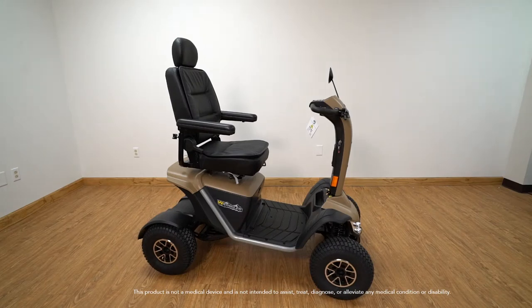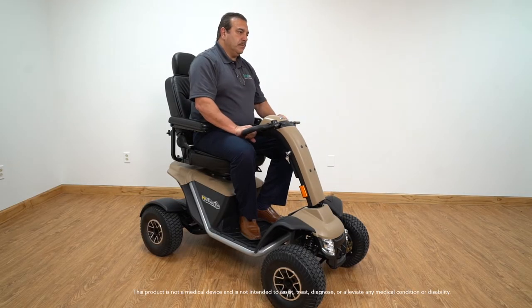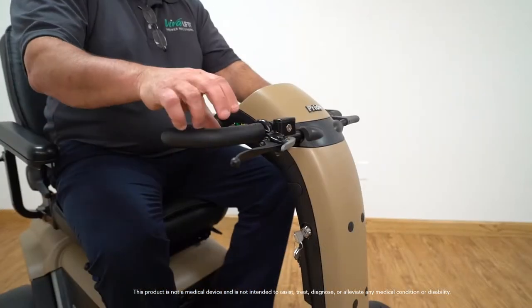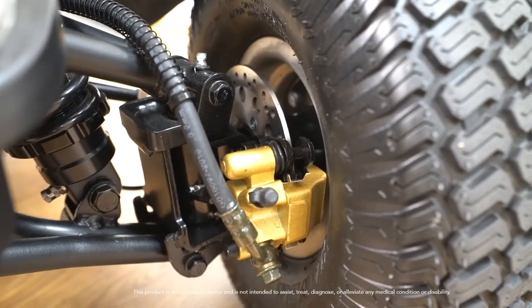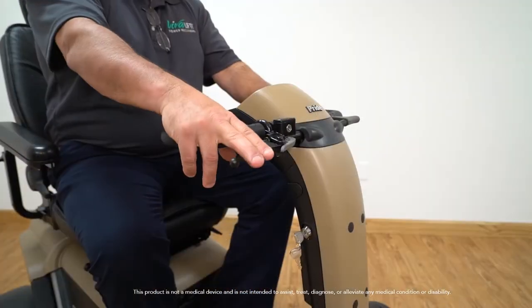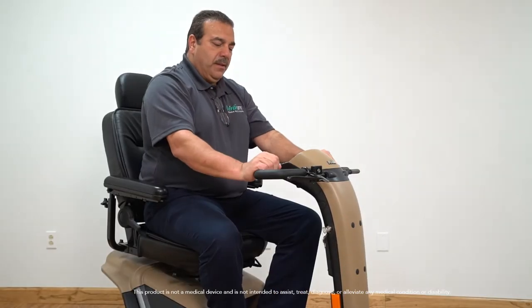Now let's go over the features and benefits of the Wrangler. Adjusting the tiller has never been easier — simply pull the lever and adjust to your comfort level. The Wrangler comes equipped with a regenerative braking system along with dual hydraulic disc brakes for added safety. It also has a parking brake to lock the Wrangler; simply use the locking lever on the brake.